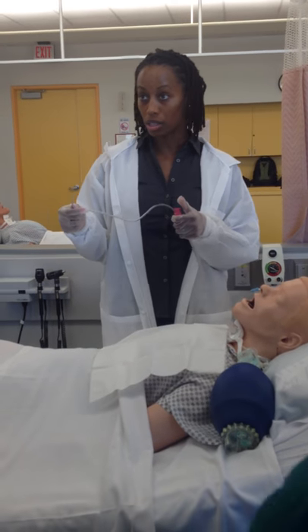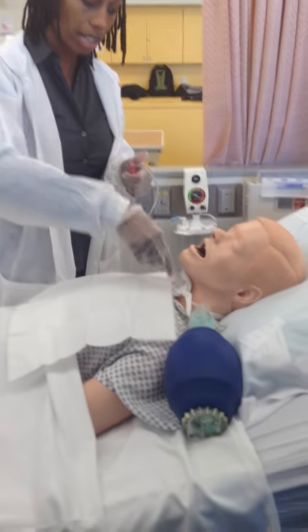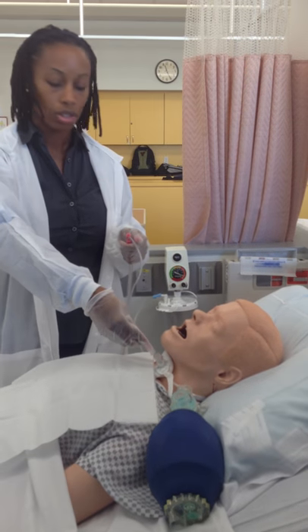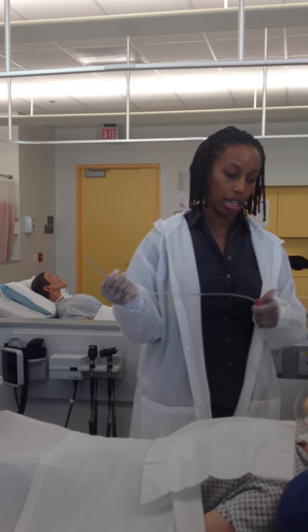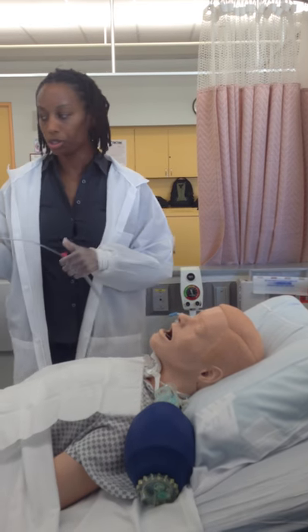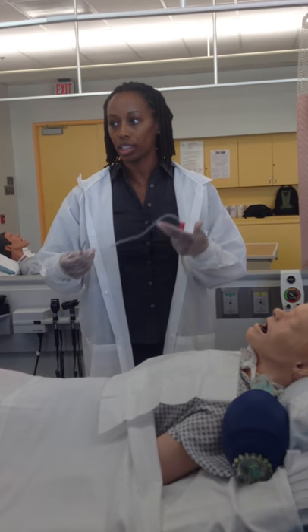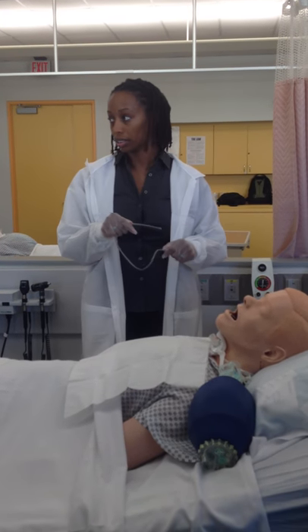They give two breaths. Once they're done, you'll go back as far as you can through their trachea until you can no longer go anymore, because they'll feel the back if they're awake and it may induce a cough. You don't suction on your way in — you only suction on your way out. You're going to completely come out. That was the first pass. Give them a couple seconds to rest, then do it again — go in a second time, same thing until you feel the back, then suction coming out. You do two passes, then have your helper pre-oxygenate again.